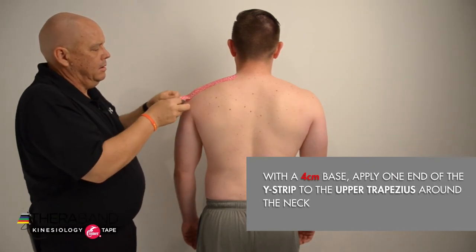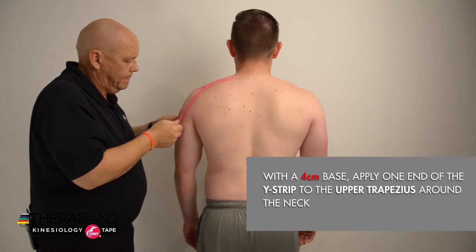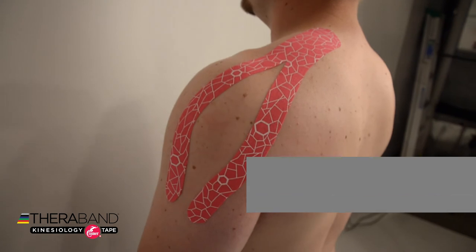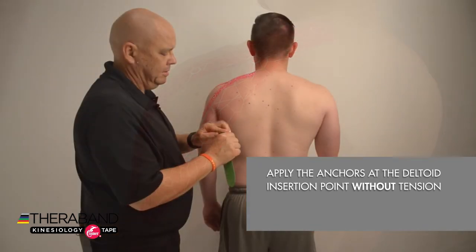Then I'll peel back the backing off of the tails and bring those tails around the deltoid, contoured at about 25 to 50%, and insert those where the deltoid inserts at the humerus with no tension on those anchors.